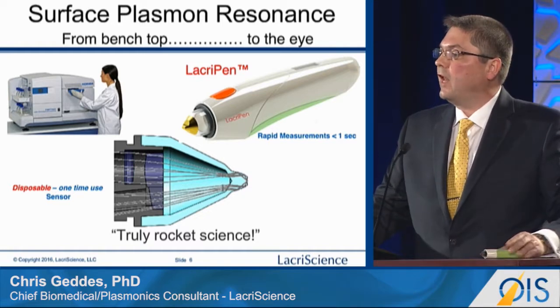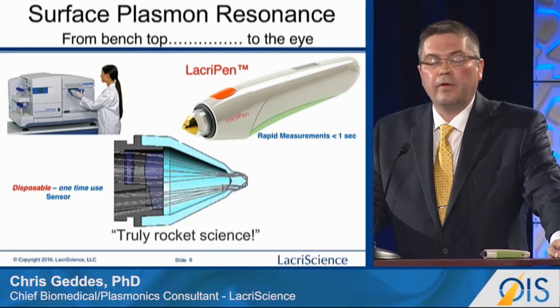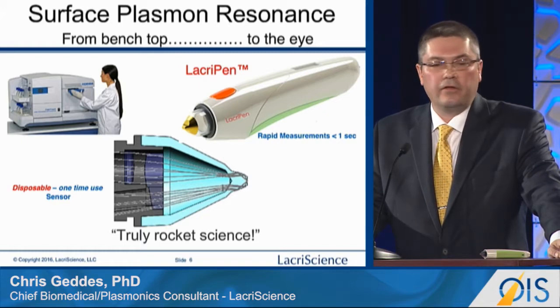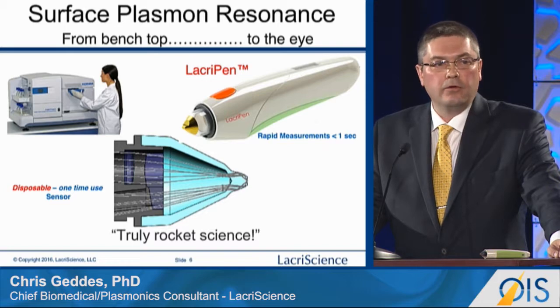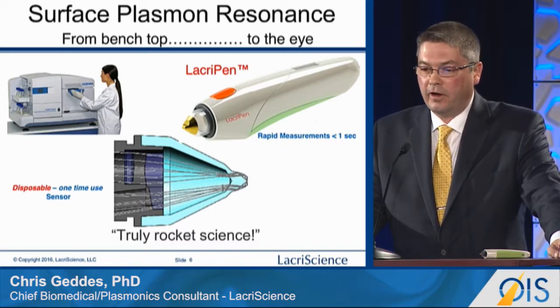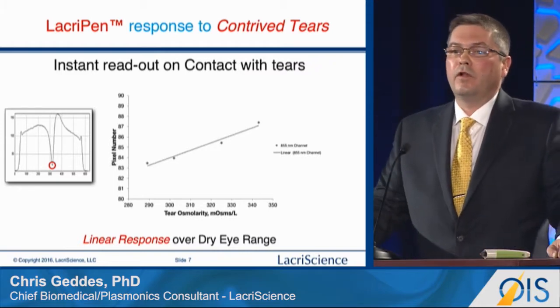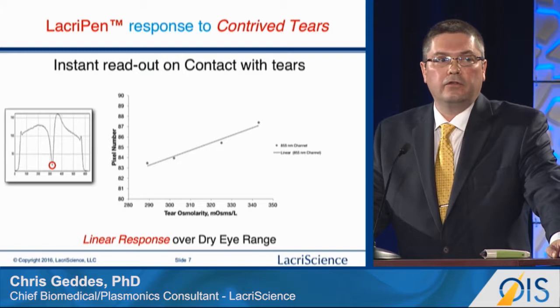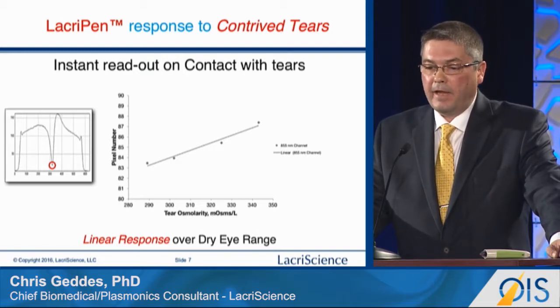The key to the success of the LacriPen is really the sensor prism, which is at the tip of the pen, and this actually touches the eye and has that little gold film on it. That's where all the fancy optics are that allow us to do multi-angle, multi-wavelength, instantaneous diagnosis of dry eye syndrome. We have tested the LacriPen so far in salt solutions, in contrived artificial tears, as well as with a few clinical and veterinary patients.